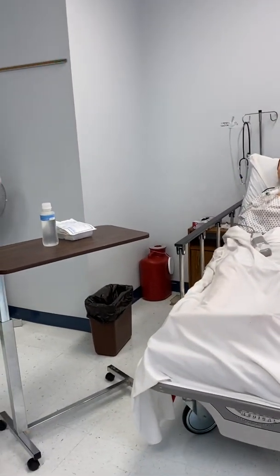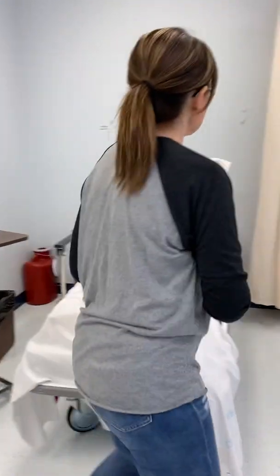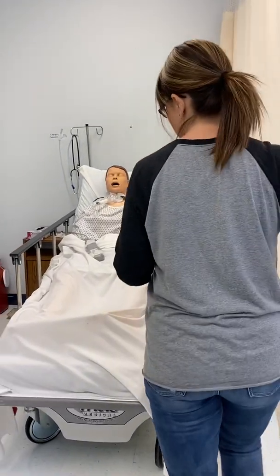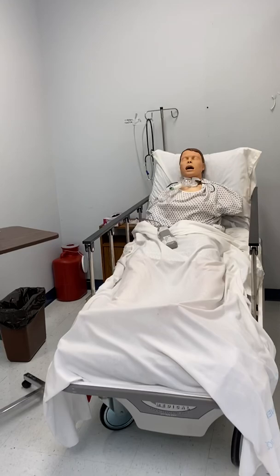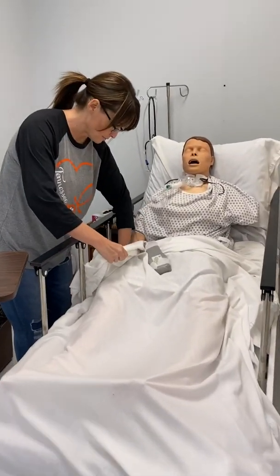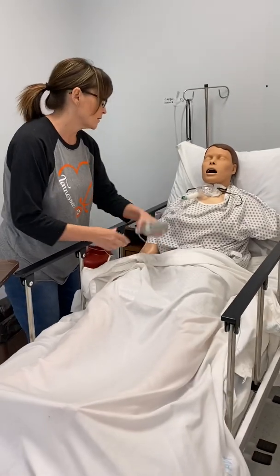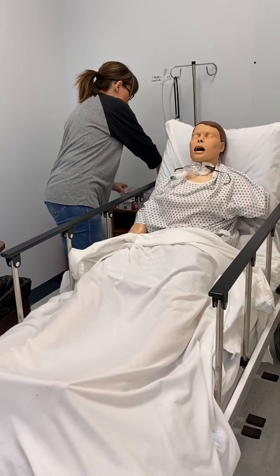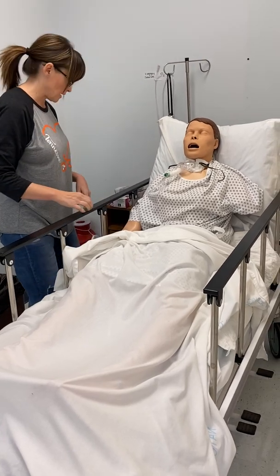Okay. Knock, knock. Hey, Mr. Smith, my name is Shelley. I'm going to be your nurse today, and I'm going to do some trach care. Can you tell me your name and date of birth? Okay. We did your suctioning already, so we're going to do your trach care afterwards.